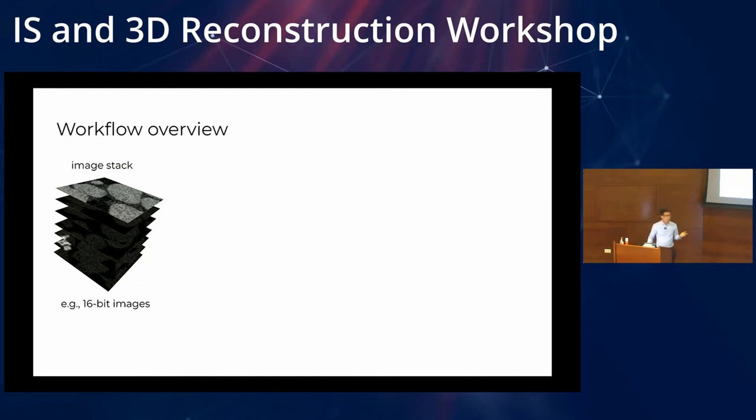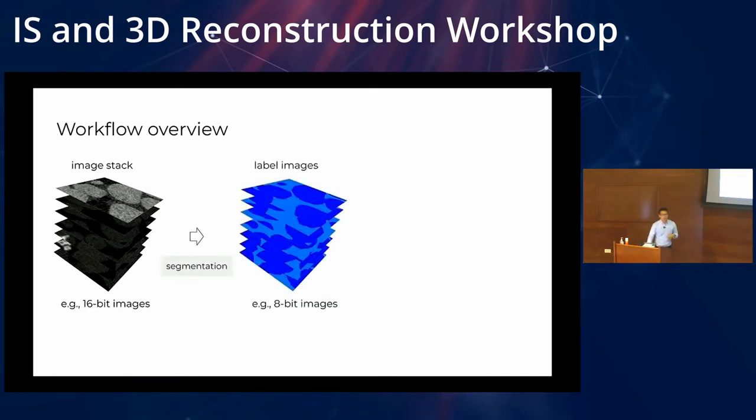Most of you are here today because you have data sets that look like this. You have image stacks that came from your imaging devices, could be CT, X-ray, you name it, and you want to perform segmentation. The main idea of segmentation is to separate the different materials or different objects in your data so that you can perform some sort of visualization or analysis.